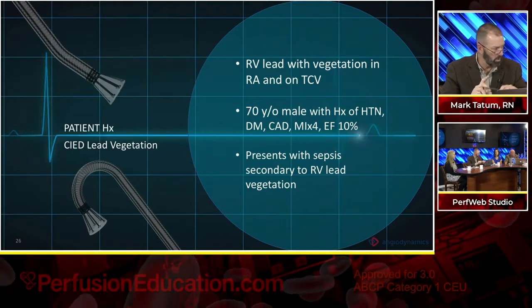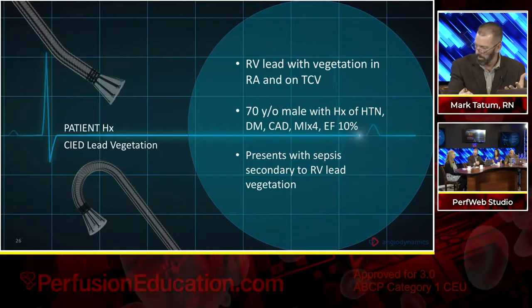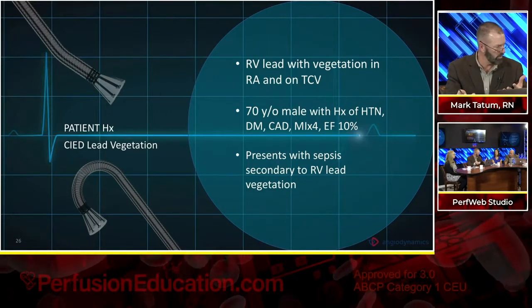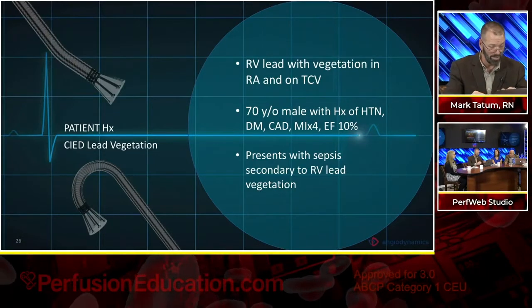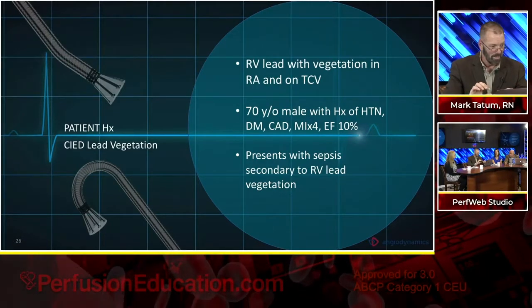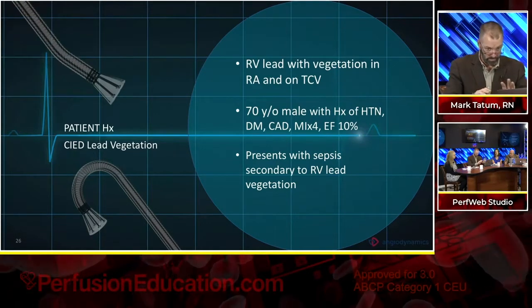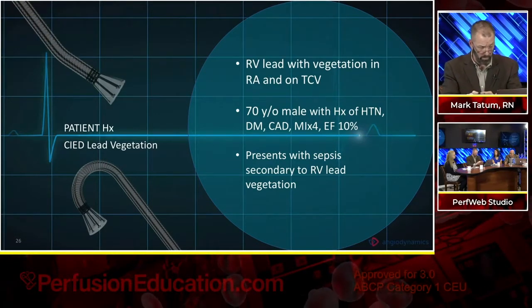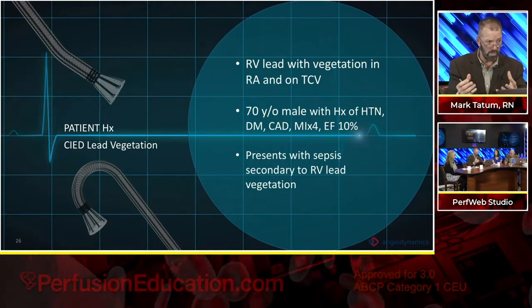I'm glad that you brought up the mild hemodilution. The cannula and circuit, the entire thing primed, is roughly 600 to 650 cc's of saline, or your favorite non-dextrose containing product. The AngioVac cannula performs better in patients who are relatively wet. They're intravascularly full.